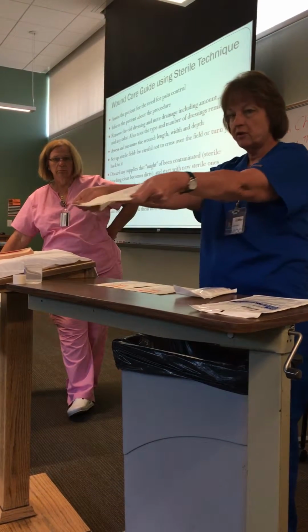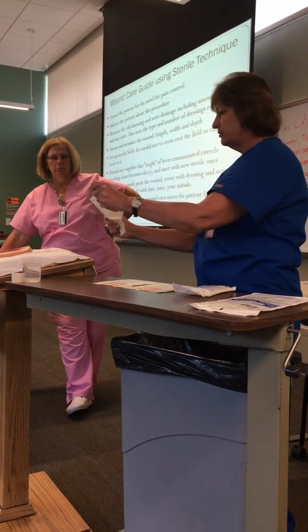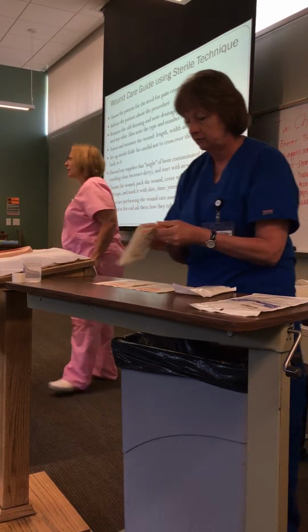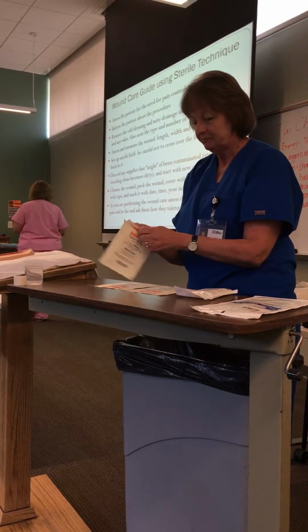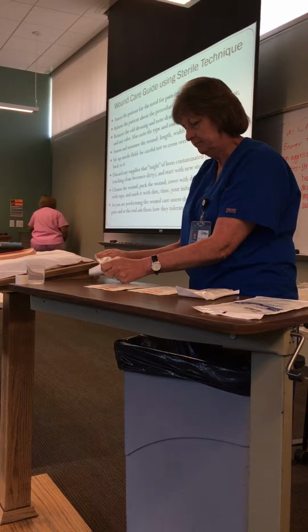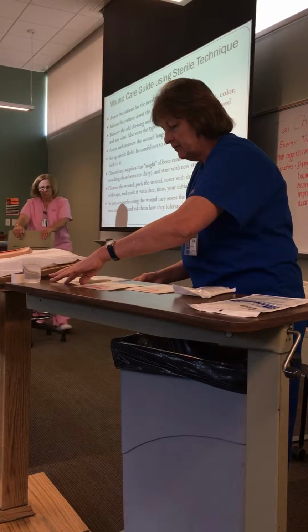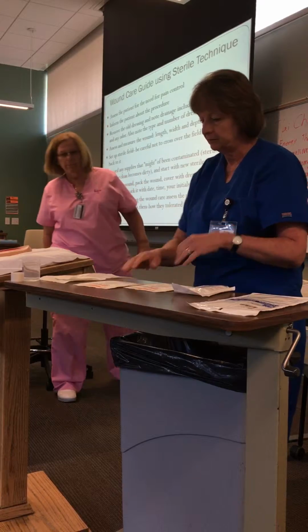Now, this one went over the edge. Would I want to use that yet? No. No, I'd throw it out and I'd get another one. And these, so we'll see if this one comes out any better. Okay. And what I'm careful to do is touch my 1-inch border only, okay? And I'm not crossing over.